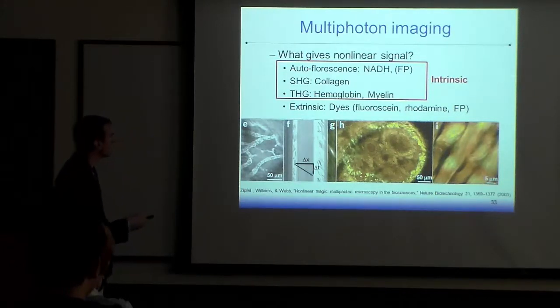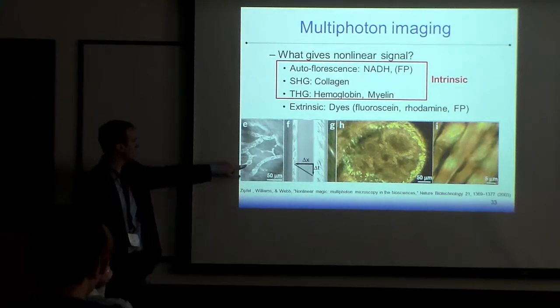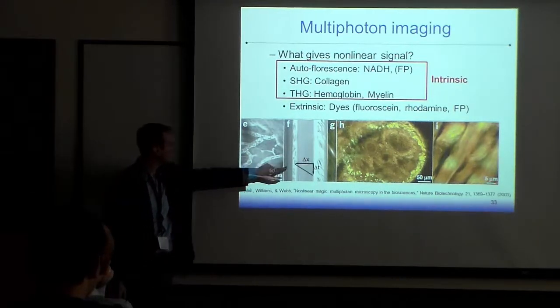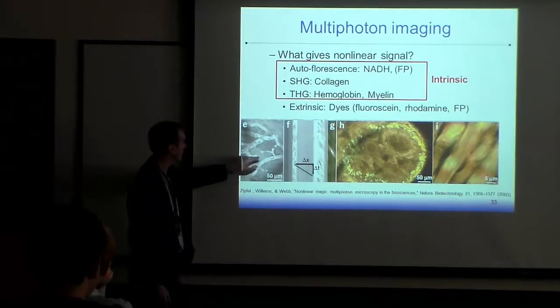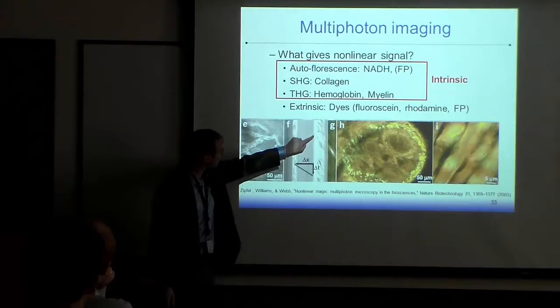These are all techniques that we can use. And here's some examples. This is blood flow inside of a brain. You can see these little specks here correspond to the blood cells. If you park a line, like we're just parked right here, and you look at the function of time, you see the blood flow is going past.